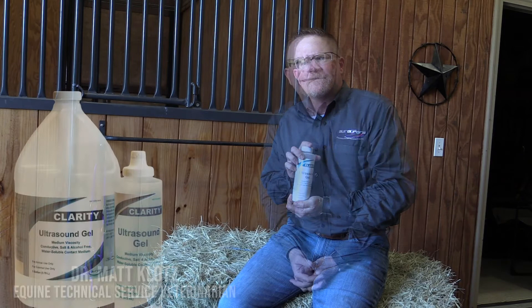Why is Clarity Ultrasound Gel my choice? Because, first of all, it's formulated without bubbles. After years of fighting bubbles trapped in ultrasound gel under my standoff pads causing artifacts, I no longer have to deal with that with Clarity.